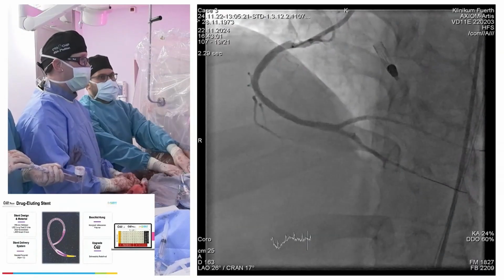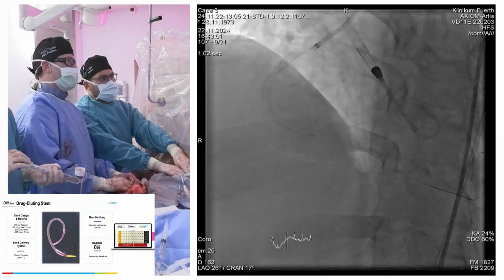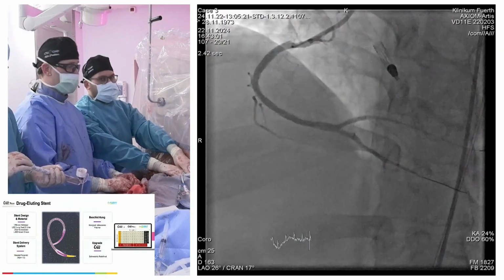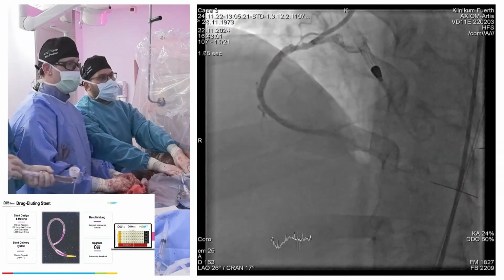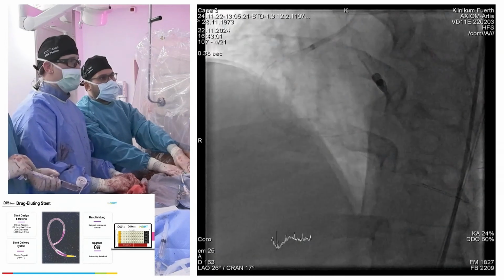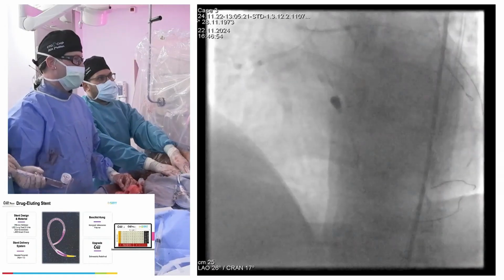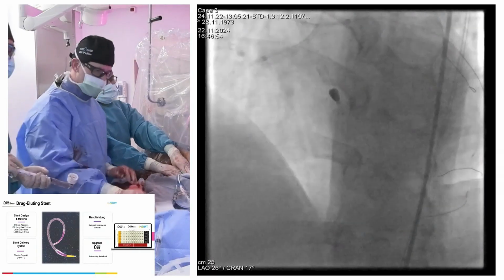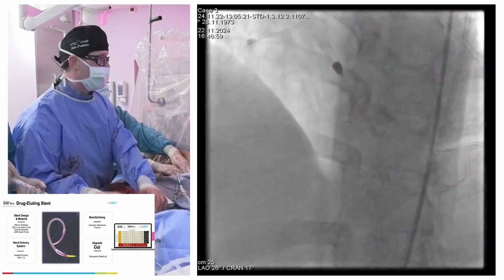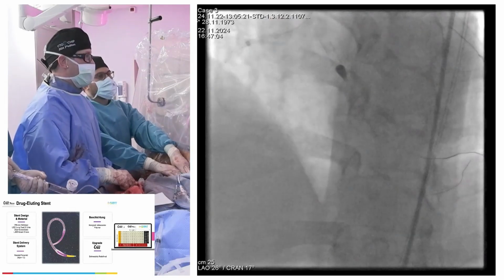Again, we're just going to do the proximal part with a short stent, just the entrance between these two branches, and then we're going to check what our retro gear has done to the small tiny collateral. We are already weaning the impeller, and we're probably going to explant it in the cath lab just to make sure that there is no additional harm.